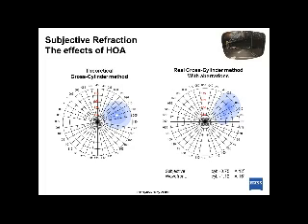Let's look at the next chart over on the right here, and you can see that there are a couple of spots with darker blue, and it's a very odd shape. That would be more the typical shape of the normal human eye. This is where you've got higher order aberrations. So the doctor in this case would pick a point, usually from the autorefraction, and ask which is better, 1 or 2. You see the patient sees better in the 2, it's in the blue. So they go to that point, which is better, 1 or 2. They don't see a difference.